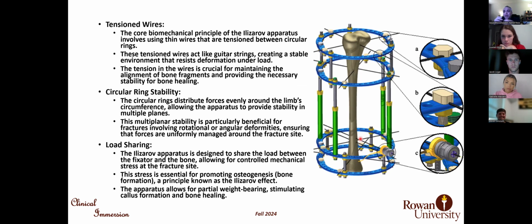And when we remove them, there are 18 scars underneath, and this is very distinctive. I always try to use something else instead of a circular fixator, and I hope I have been successful. But the main problem is infection of the pin sites.